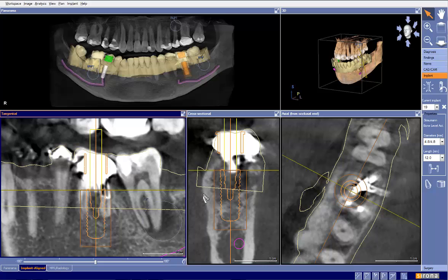So when we're done removing the tooth, we will have a defect that looks quite like that on this implant. And that's not a defect that I believe we should be doing an immediate placement on. Maybe if anything it'll come up here, but then it'll definitely drop down from the extraction site. So, let me change colors here.